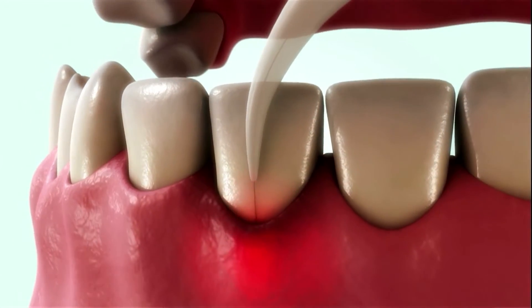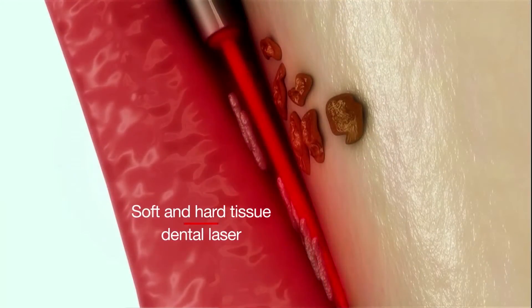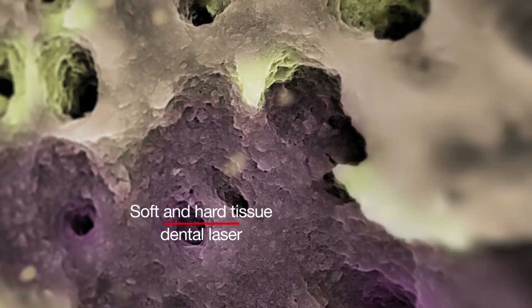The Fotona laser is a phenomenal laser. It's a dual wavelength laser that you can utilize in your practice on a daily basis for hard tissue, soft tissue. You can be doing endo, perio, regular restorative work.